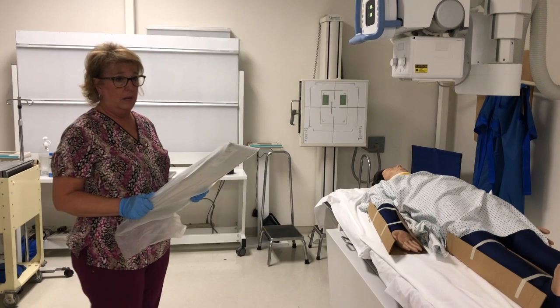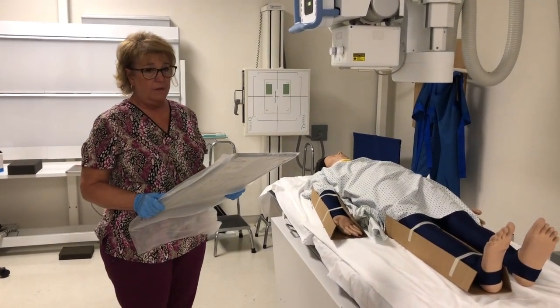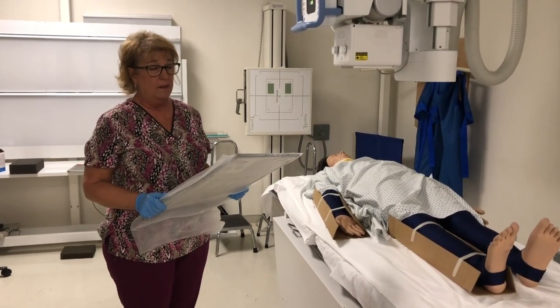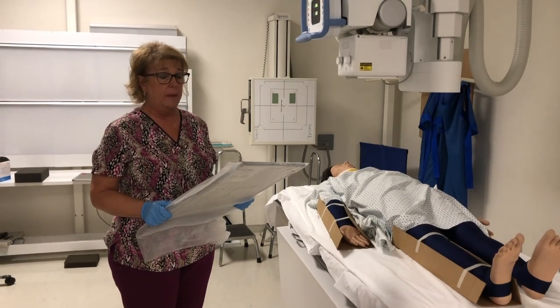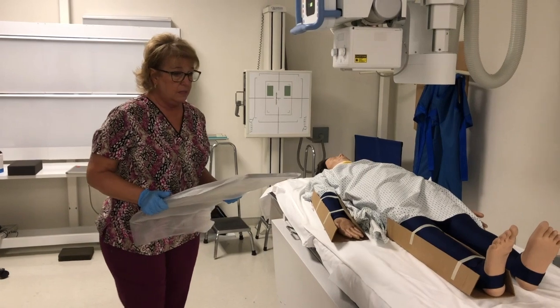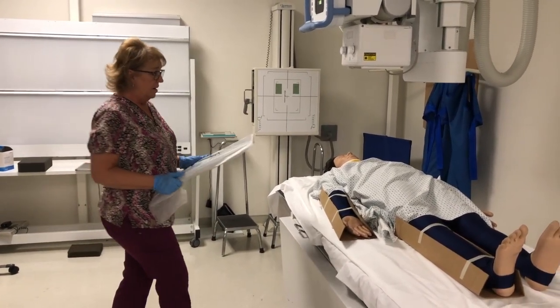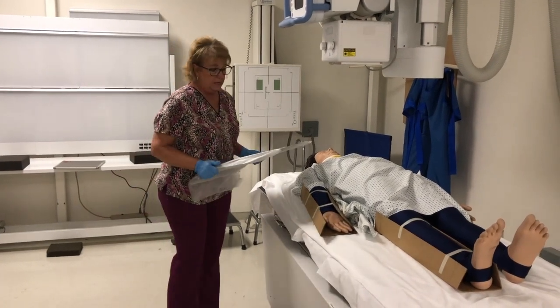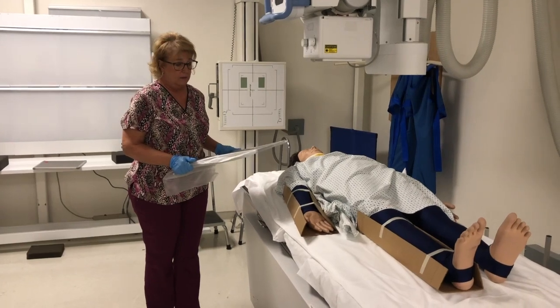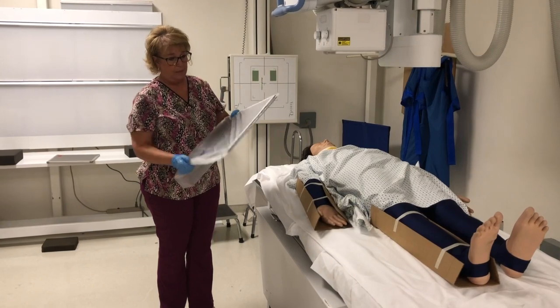Before I go into the cross-table spine work, I'm going to assess, at least in an AP view, their extremities. That way I can know what kind of fracture I'm dealing with and determine how best to support the limbs during the cross-table spine work. This is where ideally you do need a second tech, because the limb needs to be supported while a second tech is putting the bagged radiographic plate under the limb.